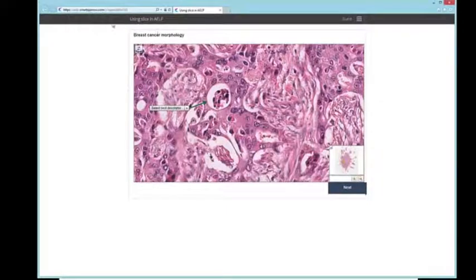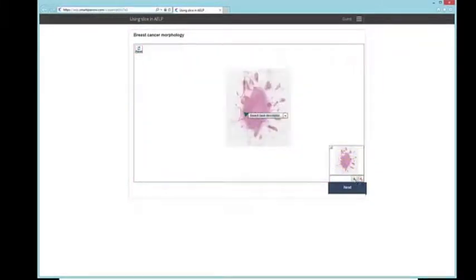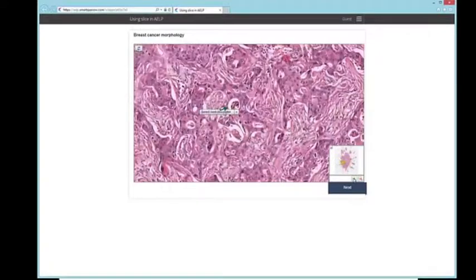But this is a URL here. If you went to that URL, you would see this. It's publicly available. It's a little quiz, and I wanted the student to tell me what that thing was. It relates obviously to the prac class we just talked about. The important thing here is to realize that we are looking at the same thing. We're looking at a virtual slide, and I can zoom back out and see our old friend, breast cancer, there.